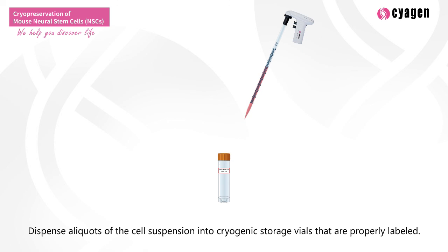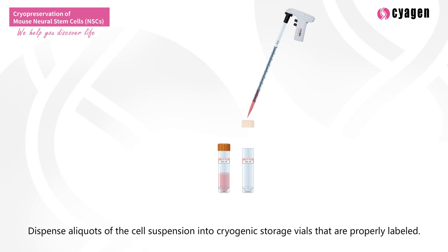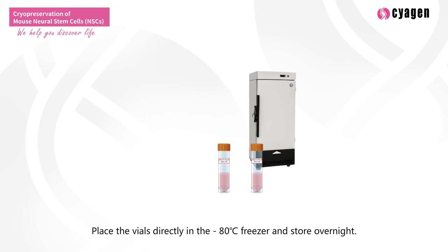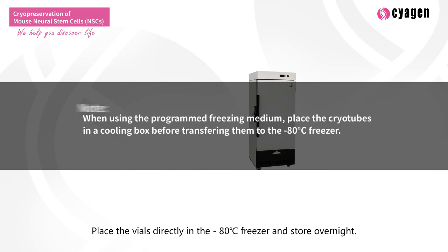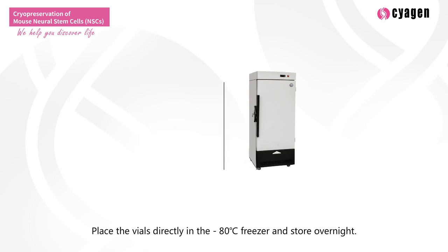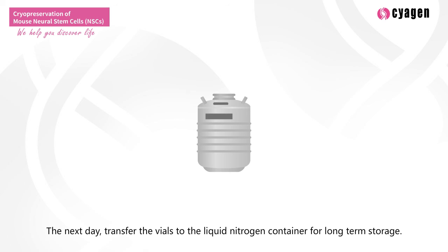Dispense aliquots of the cell suspension into cryogenic storage vials that are properly labeled. Place the vials directly in the -80 degrees Celsius freezer and store overnight. The next day, transfer the vials to the liquid nitrogen container for long-term storage.